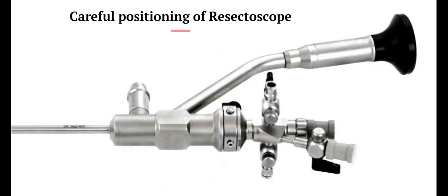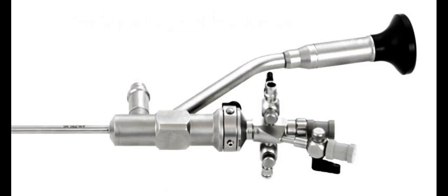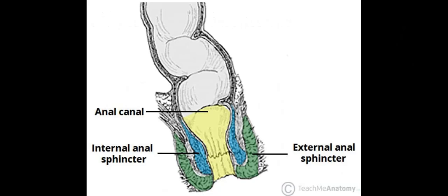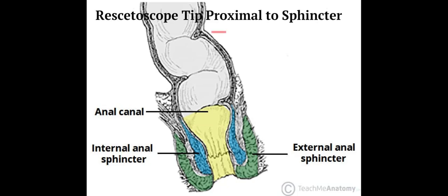Because the area of resection is at the prostatic apex, near both the external urethral sphincter and the rectum, careful and constant positioning of the resectoscope is essential. A finger placed in the rectum can help avoid rectal injuries and assist in keeping the resectoscope tip proximal to the external sphincter.